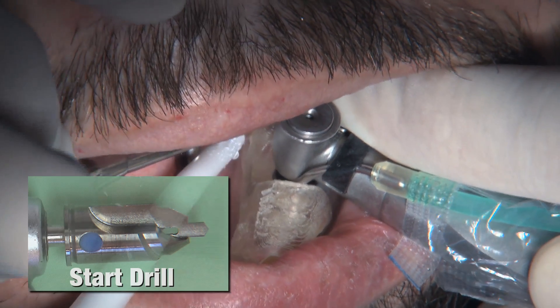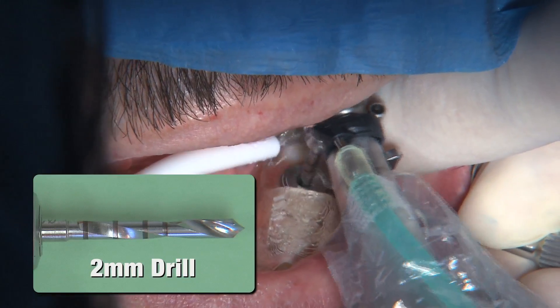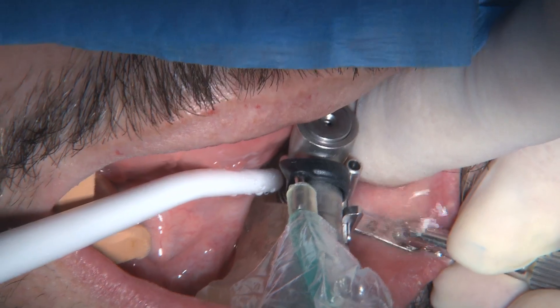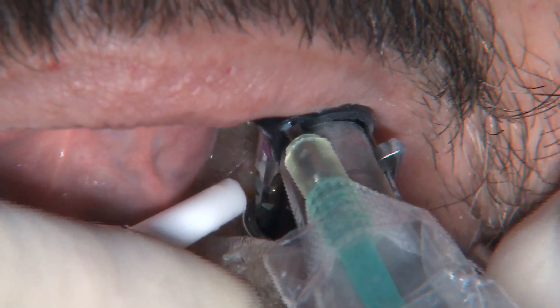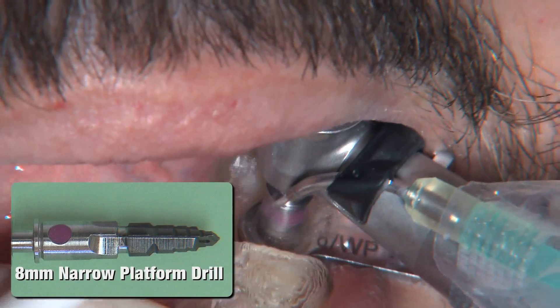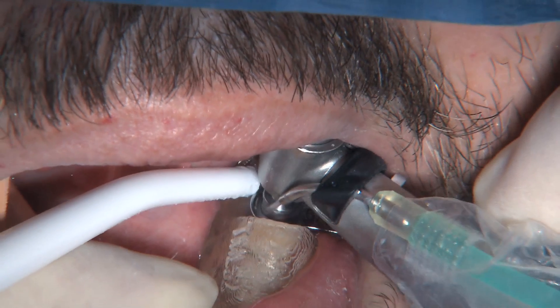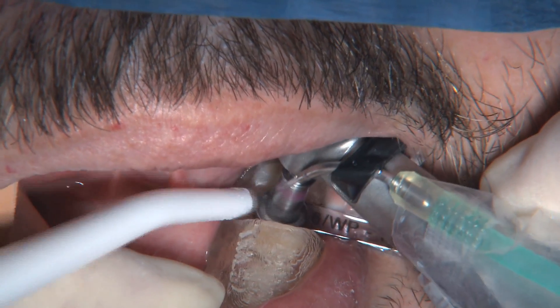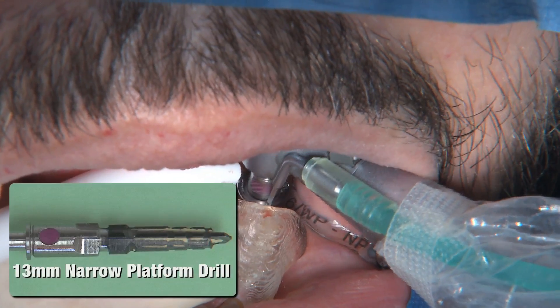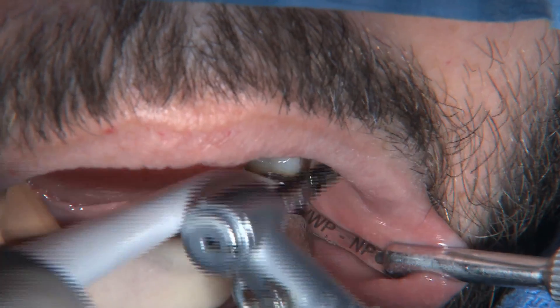Once the tissue punch has been advanced to its full depth, it's time for the first drill — a two millimeter drill. The insert in my right hand fits inside the surgical guide, ensuring there's only one direction this drill can go. The next drill is the eight millimeter narrow platform drill, and again with another insert in the surgical guide, we push our way down to full depth. You can see the vertical stop — the drill simply will not go any deeper than allowed by the surgical guide, allowing me to make this osteotomy with a high degree of confidence that I'm nowhere near the nerve.